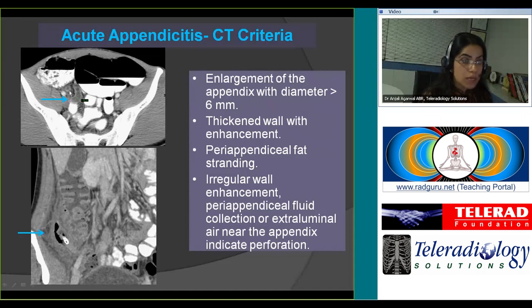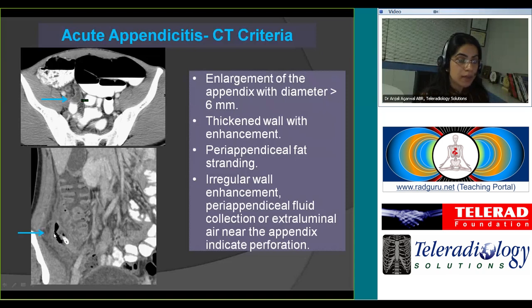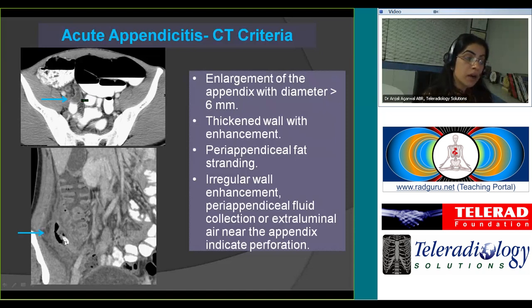One can also see thickening of the appendiceal wall with increased mucosal enhancement. You may also see peri-appendiceal fat stranding — this 'dirty fat' indicated by the blue arrows. If you see irregular wall enhancement, peri-appendiceal air or fluid, you can confidently suggest the presence of perforation. There is a very high positive correlation between the presence of an appendicolith in appendicitis and perforation or impending perforation.